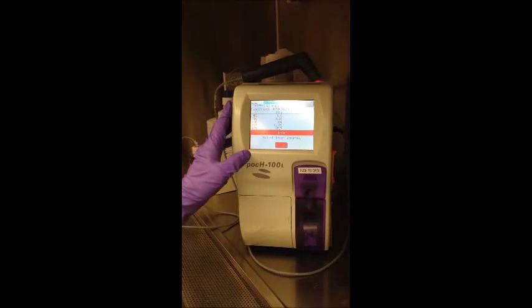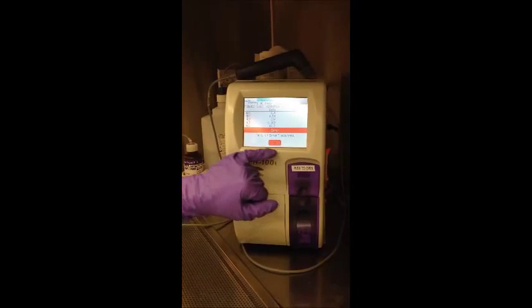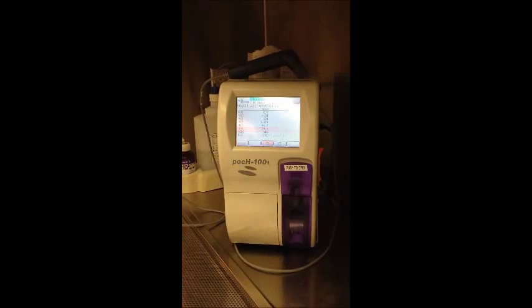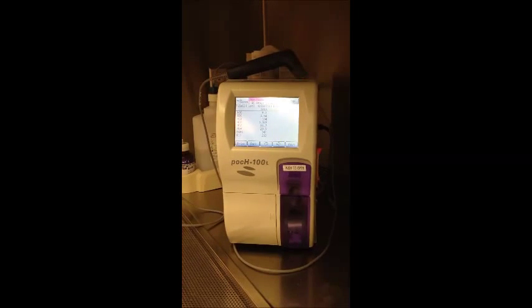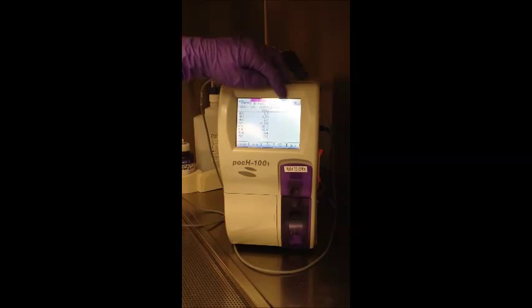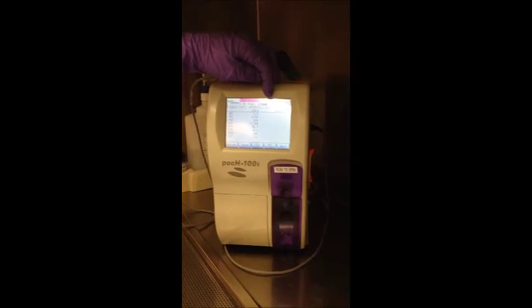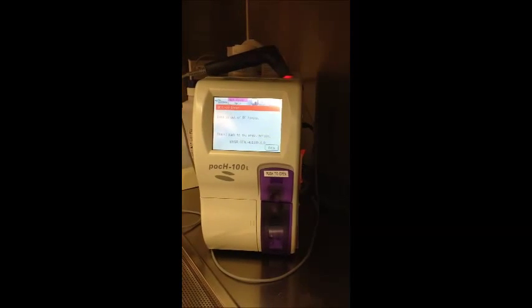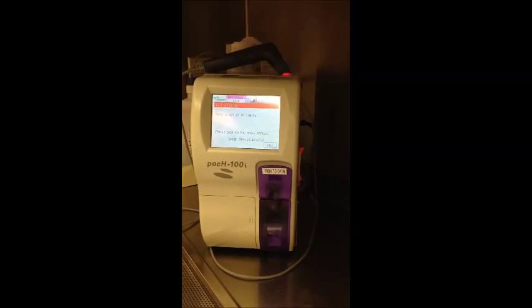On this last QC, we've got an error, which is pretty evident on the screen. We'll say OK to silence the error. And we can press on this flashing indicator at the top. It's like a little man with a question mark. Data is out of QC limits.